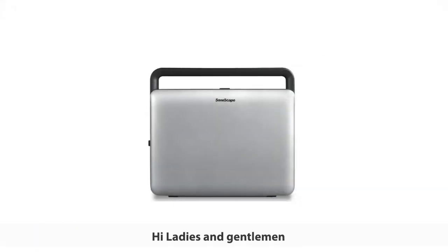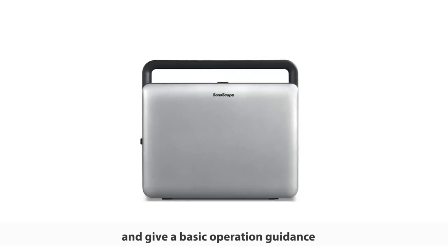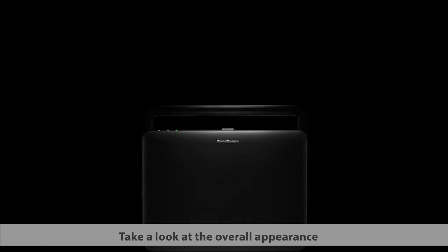Hi ladies and gentlemen, today I would like to introduce you to our laptop product X5 and give a basic operation guidance. Take a look at the overall appearance.